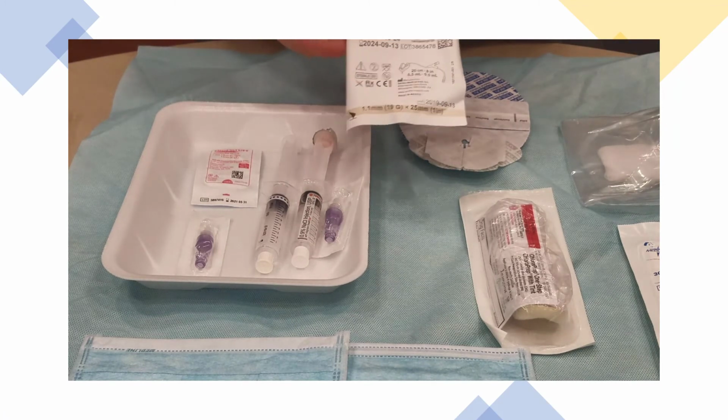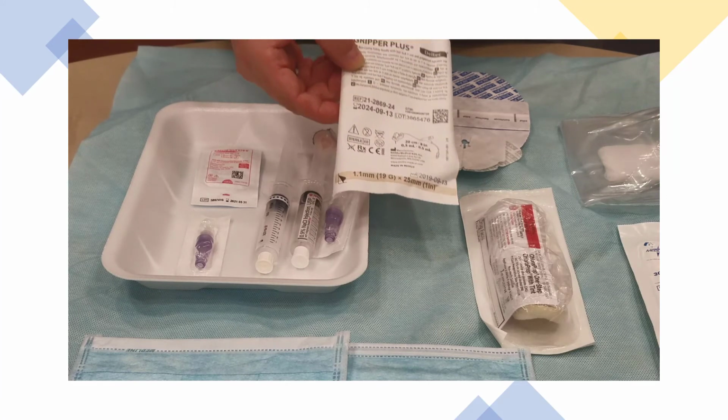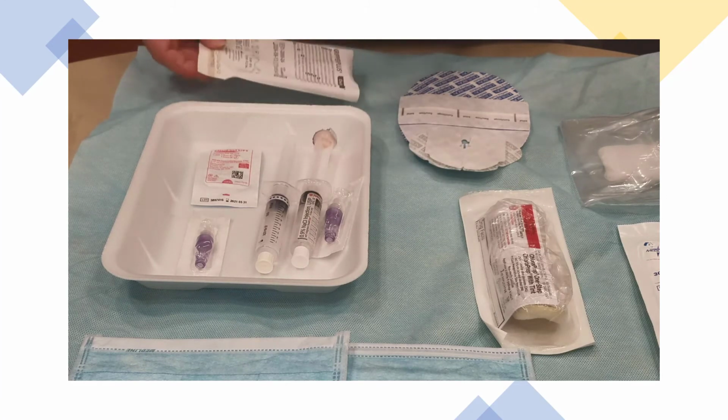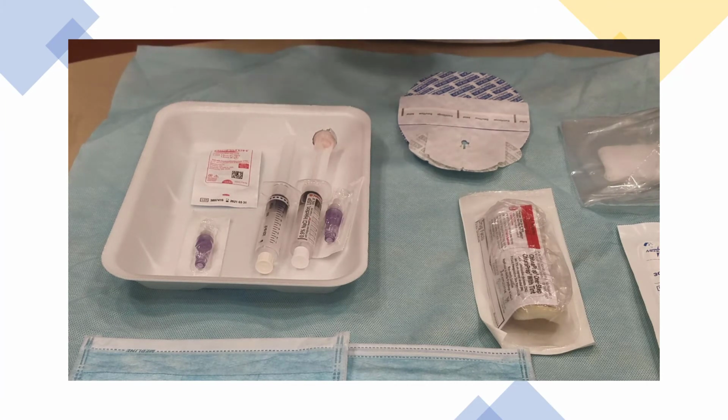You're going to need a Huber needle. Here's an example of a non-power port Huber needle. You do not want to lay it on the sterile field as I just did. So first things first, figure out what kind of power port you have and what kind of access you need. If you're going to be power injecting, you need to make sure that you have the power port and the power injector Huber needle.